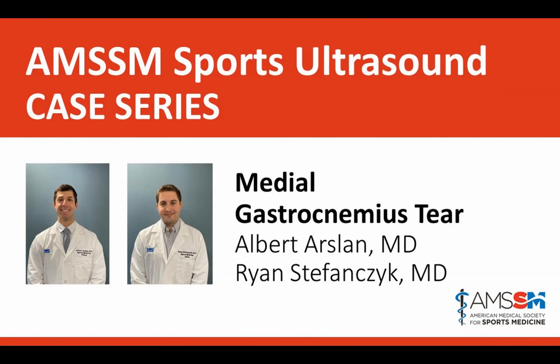The other thing that can be really helpful with this is that a lot of people that have really persistent hematomas tend to struggle. And so I'll frequently, if there is a hematoma that's amenable to aspiration and someone's a little bit slow, re-imaging can help guide you towards draining that blood product out and allowing that scar to settle back in.